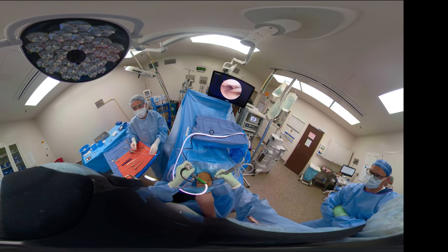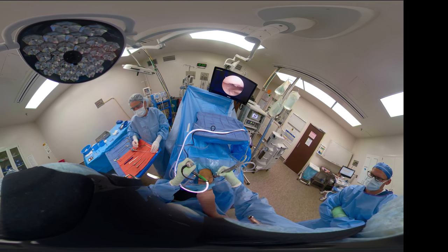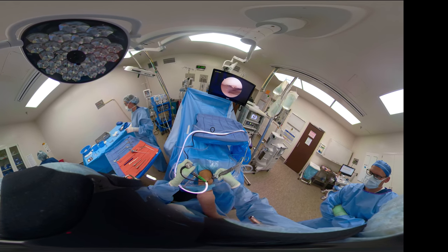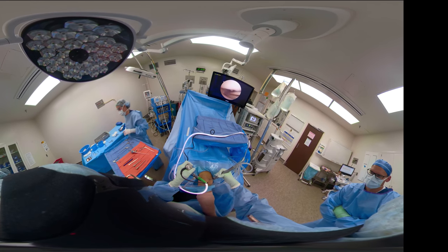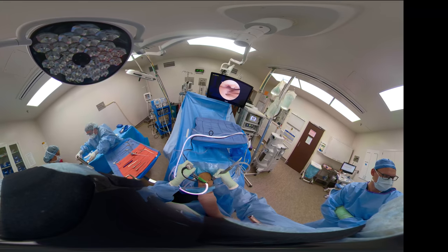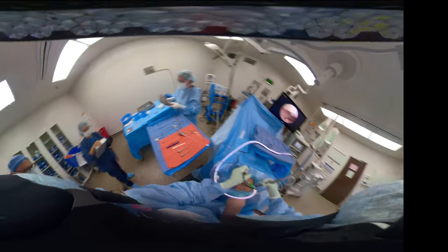You can see the water there on the right. Sometimes the bags have to be up higher to develop more of a pressure head because we're using gravity for pressure. I don't use any pressure pumps in the knee, so this is gravity pressure. And we're using oscillate just to shave that meniscus.